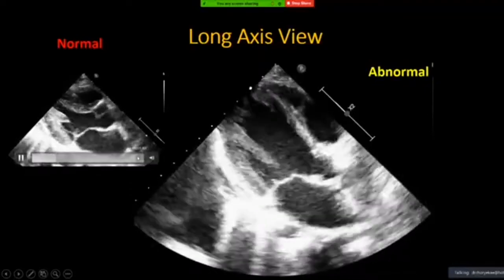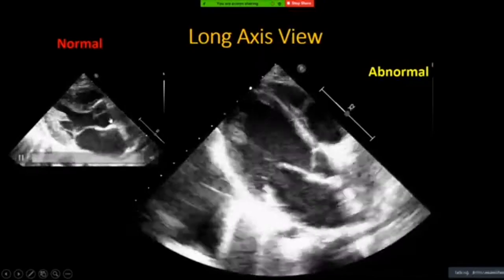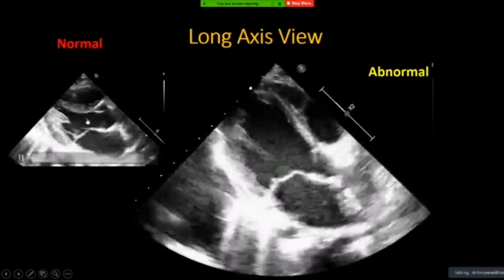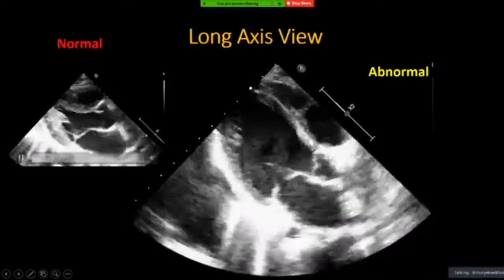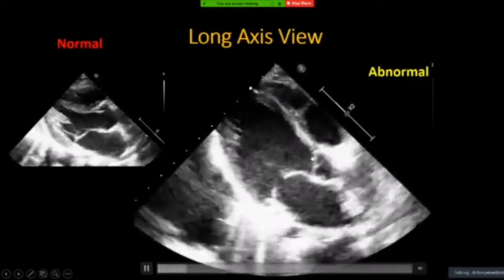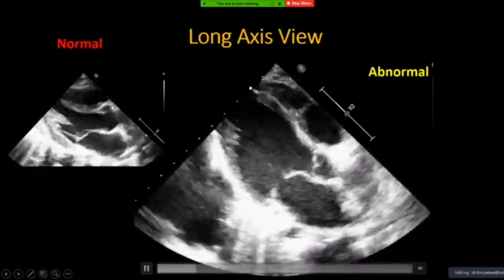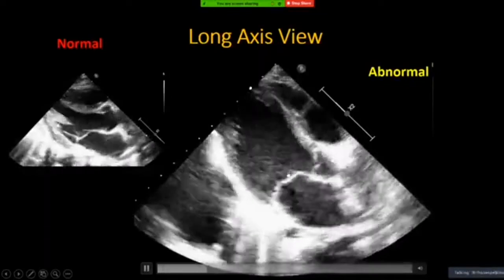Earlier on we talked about left atrial size and the aorta, the aortic outflow. We say that hopefully most of the time they will be nearly equal in size, but we look at it carefully here. The aorta is here and the left atrium is here, right? It seems like the left atrium is slightly big, so a slightly biggish left atrium.